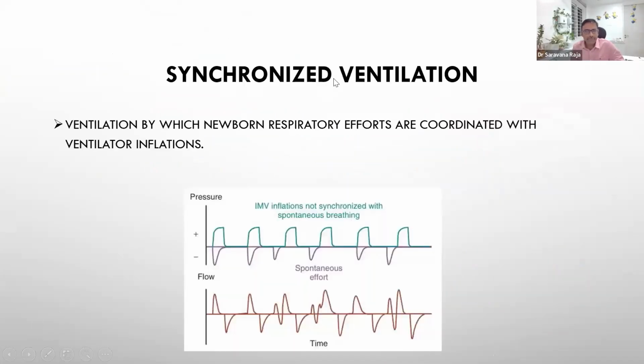Topic for my today's presentation is synchronization in newborn ventilation. So what do you mean by synchronized ventilation? It is a ventilation by which newborn respiratory efforts are coordinated with the ventilator inflations.